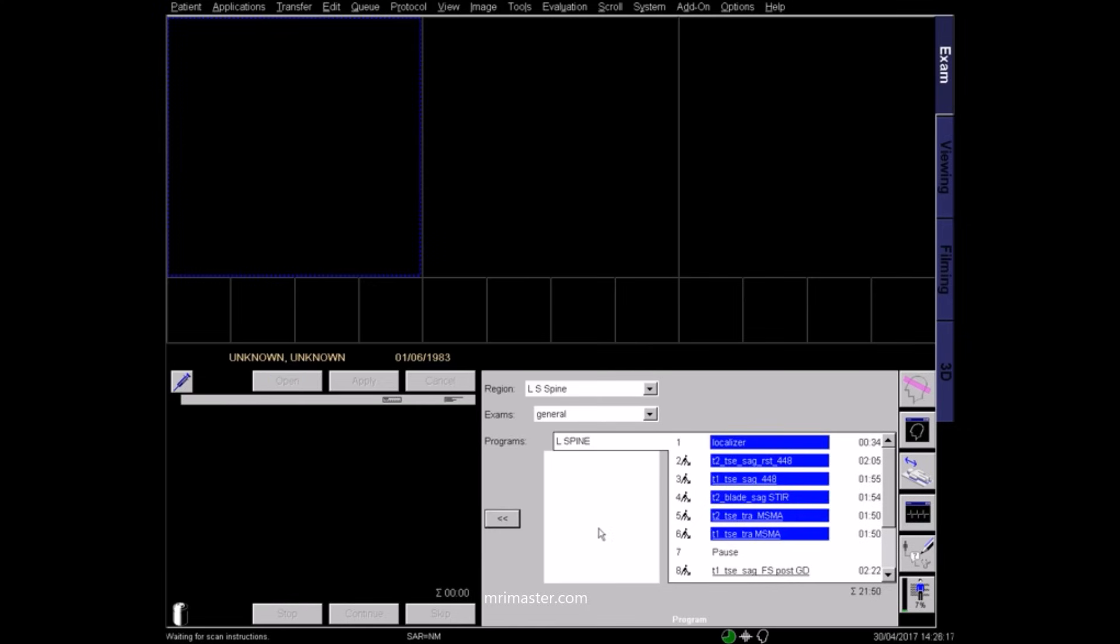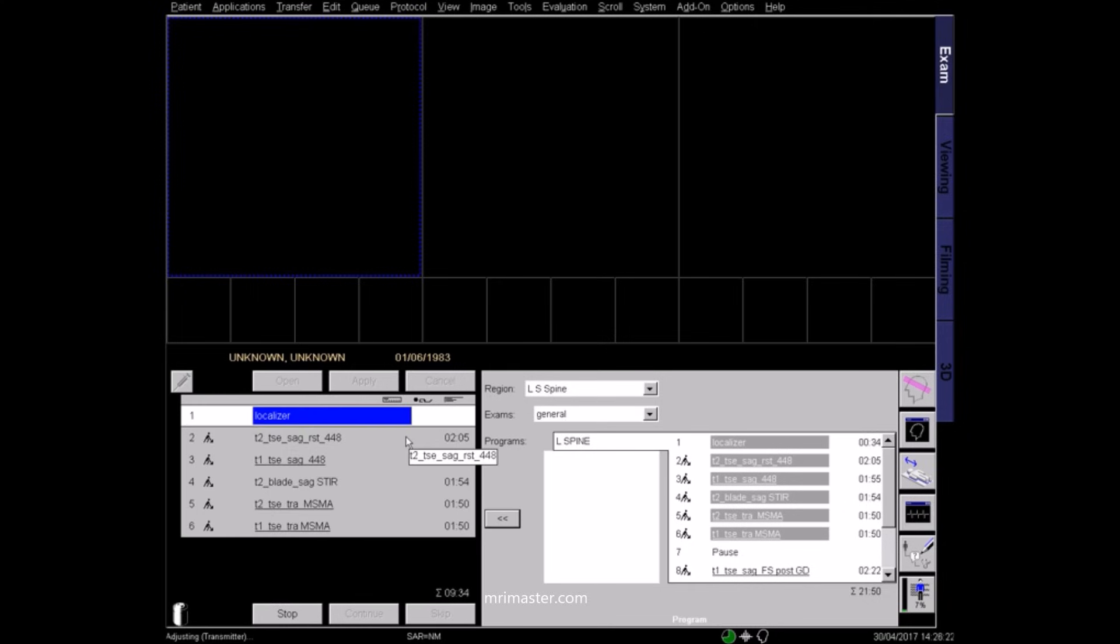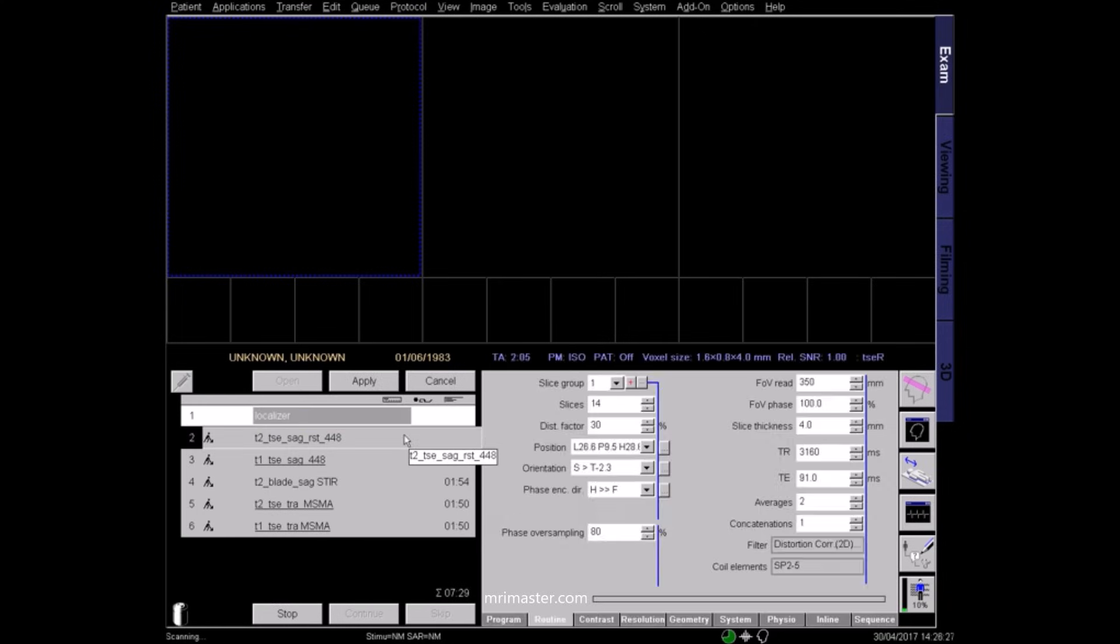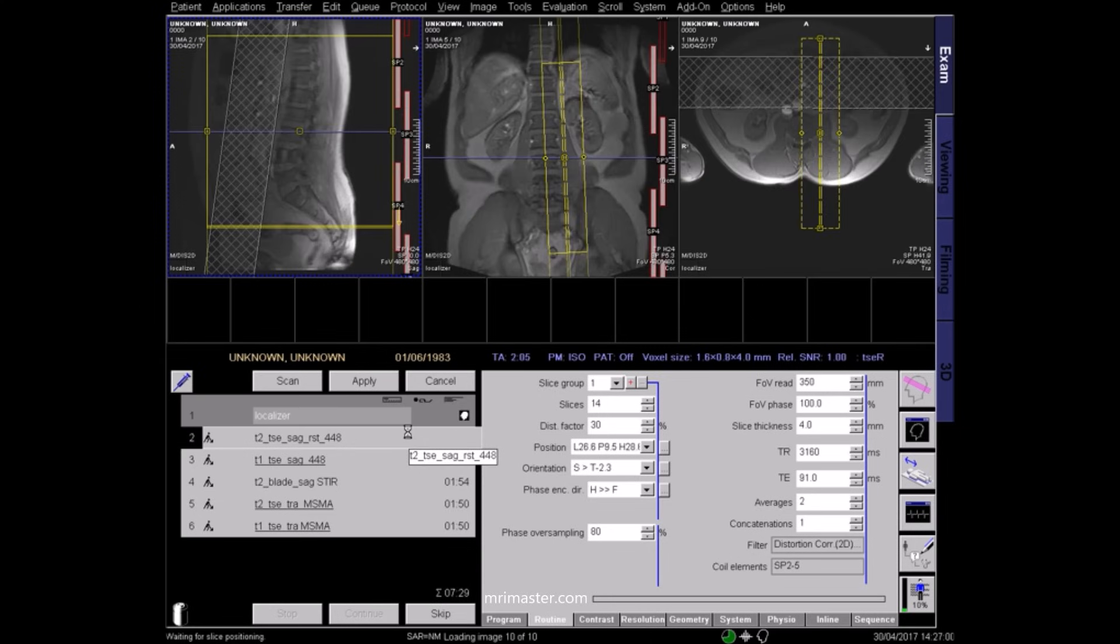Select the sequences according to hospital and radiologist protocols. In this protocol we have three sagittal sequences and two axial sequences. Begin the scan with a three-plane localizer.